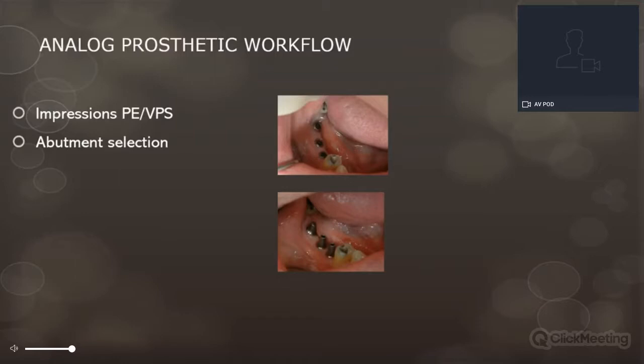We have the appointment of the abutment selection. Traditionally, we used to use preformed titanium abutments. So the placements, also the angulations, had to be critical for these to be effective. Otherwise, we had to use angled abutments.